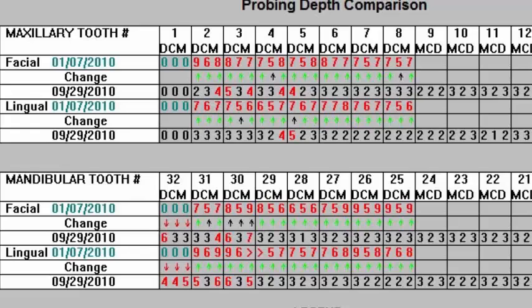Fortunately, this patient did not go to that type of office and had the LANAP procedure done, and will now be able to keep their teeth long term. This is one side, and then the other side — again, double digits.